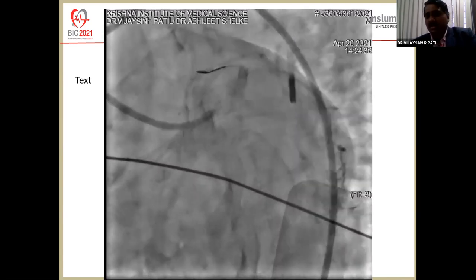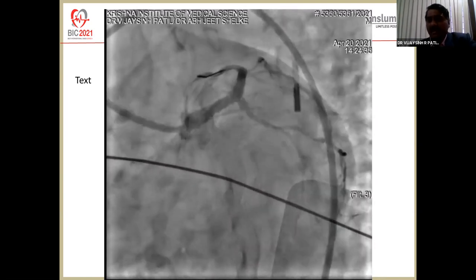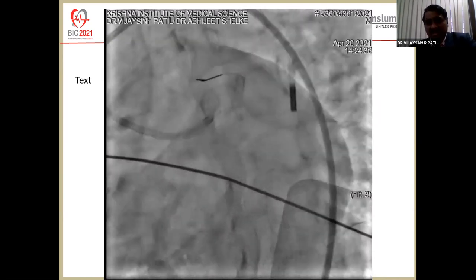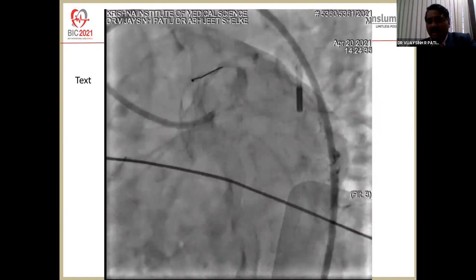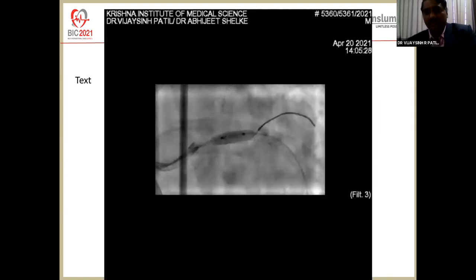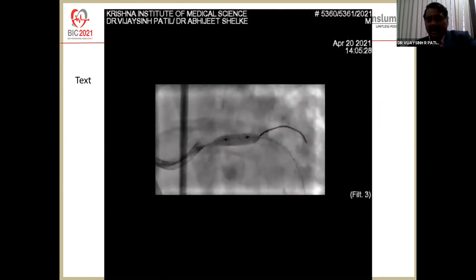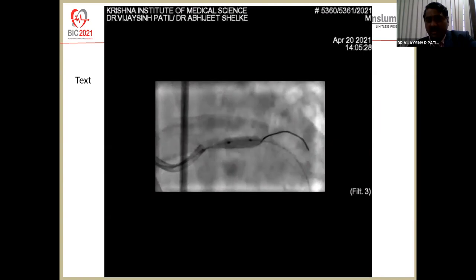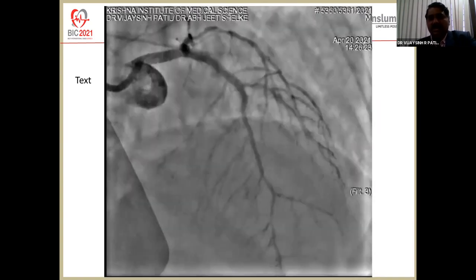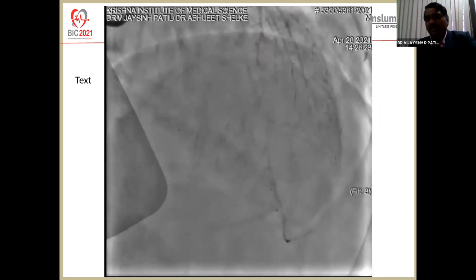So by this time, the contralateral side groin was prepared, and IABP was in place. And once the IABP was in place, we decided we will take a 4.5 by 8 non-compliant balloon, and we inflated it to almost 20 atmospheres to optimize the left main portion of the stent. And that was a good, fruitful result. Patient was hemodynamically stable. Without even intubation, we could bail him out.